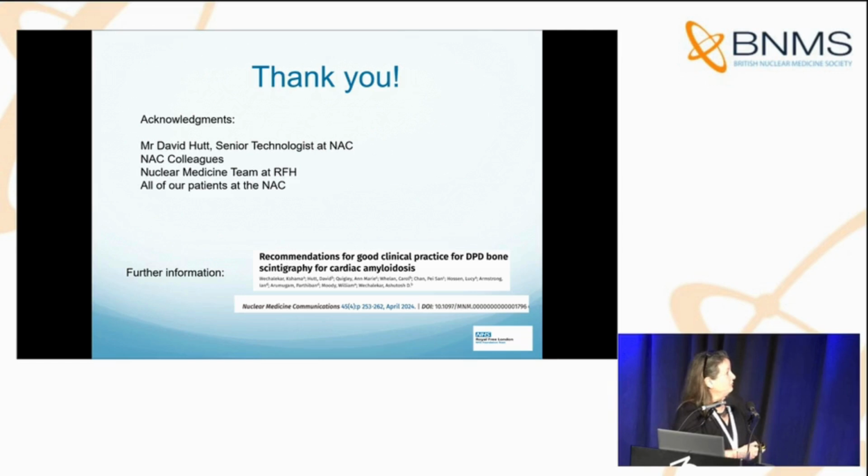And this is the reference for the guidelines that have been put together and published in April. It kind of tells you how to do it, all the tracer details, all the scanning, how to actually perform the scan, and basically summarises what we've said today.